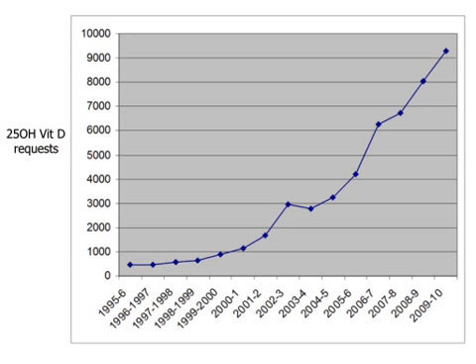Okay, so as I mentioned before, there's been quite a large increase in interest in measuring this metabolite. This is just a graph of the number of requests we got for this in the lab where I was working in Cambridge in the UK. And just in the space of, say, 10 years, the number of samples went from 500 a year to about 10,000. And that continued to grow to 20,000, 30,000 samples by 2014. And that's very similar to what we see in the labs here in Australia. We're getting about 30,000 samples a year.